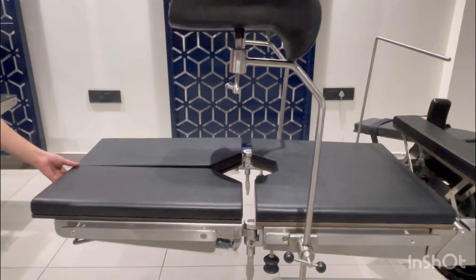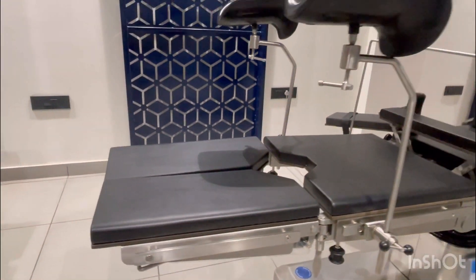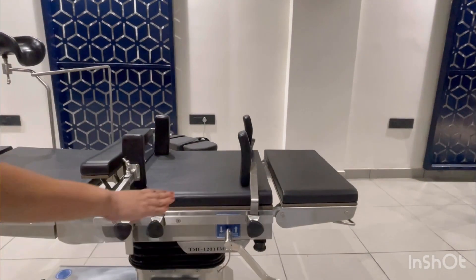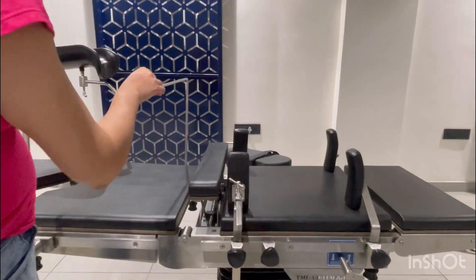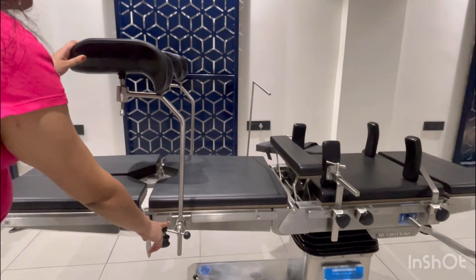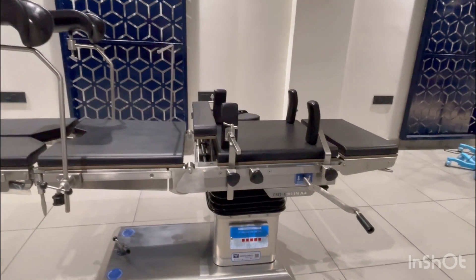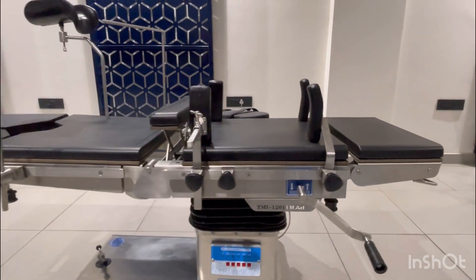The split leg section is available in all the tables. The table comes along with standard accessories: shoulder support, side support, anesthetic screen, leg support with clamps, and a handle to operate the manual override system.